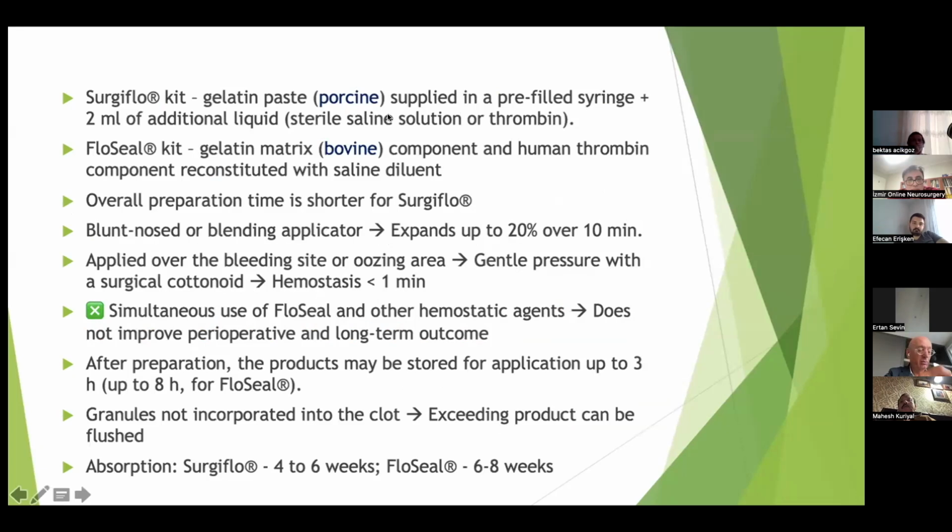Why are they giving this option? Because thrombin is quite expensive, and some units, especially cardiac surgeons and all, will be directly using thrombin in a separate pack. So there is no need for this to come along with thrombin, because thrombin is anyway being used separately.